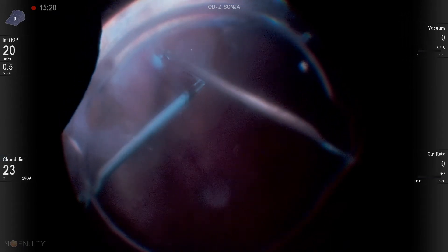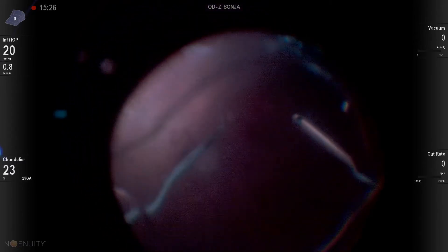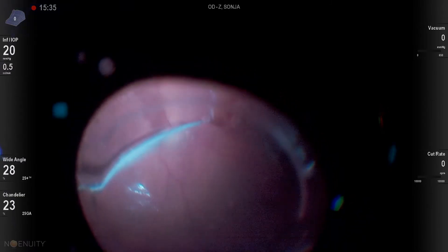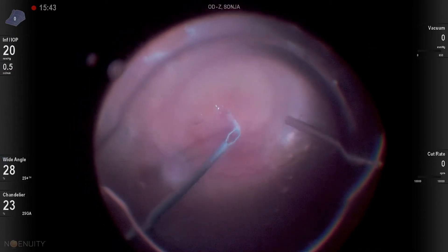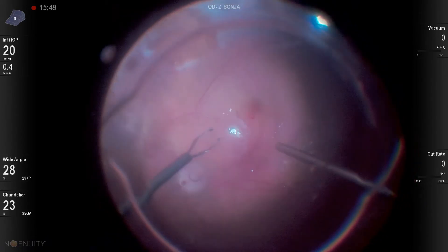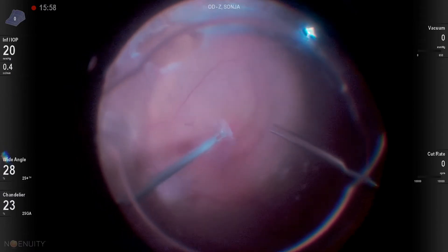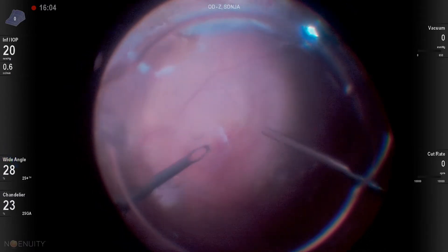Now I have it in my forceps and I'm actually able to slide it through the oil, get it under the oil over the macula, and get it into position. I wasn't sure if this was going to work, and actually it worked amazingly well. I have to use my light pipe to get it off the forceps, but you can see here it lays nicely down under the silicone oil. I use closed forceps to tease it and maneuver it into position.